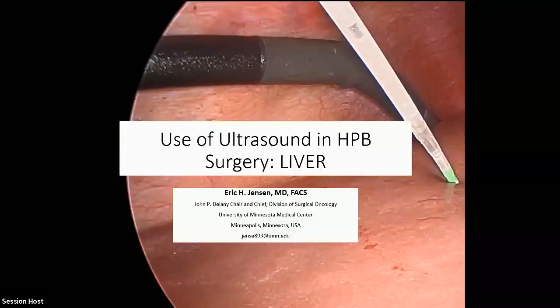I'll make a couple of comments that I didn't want to shout from the back. If you don't have a cholecystoscope, it doesn't matter. You can use a ureteroscope. Actually, at our hospital, the ureteroscopes have way better resolution, so I just found that out last week when I needed one. So I'm going to use theirs from now on.